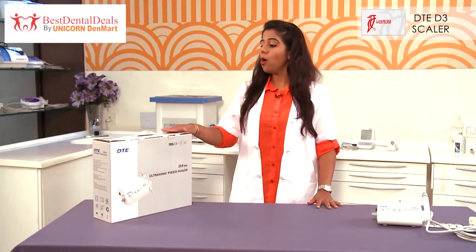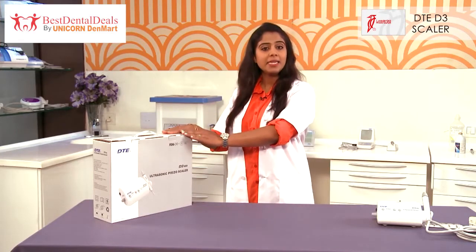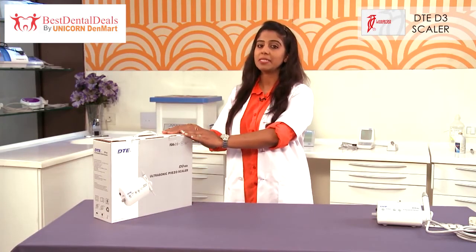Woodpecker, an already established brand in the dental market, and the DTE-D3 Ultrasonic Piezon Scaler is a new and latest offering from Unicorn Denmark Limited.